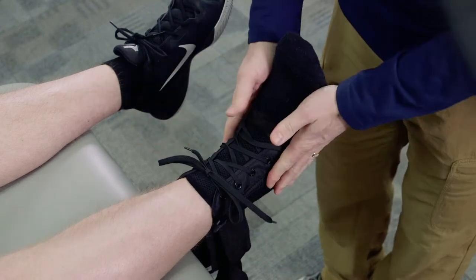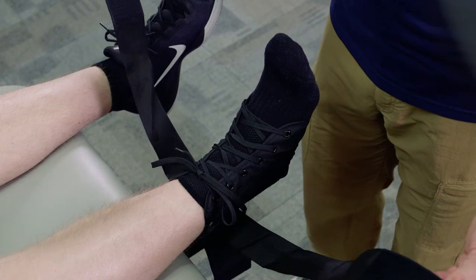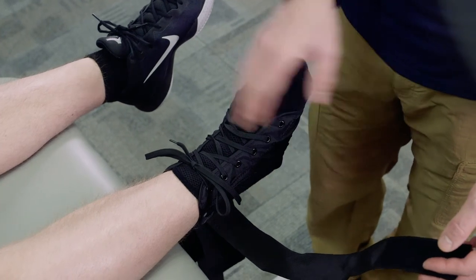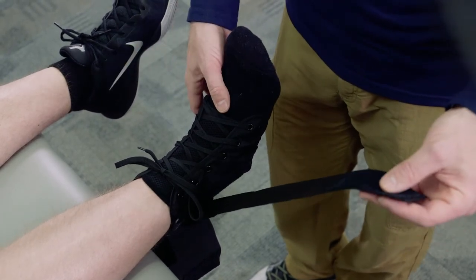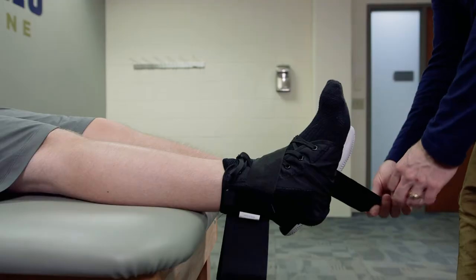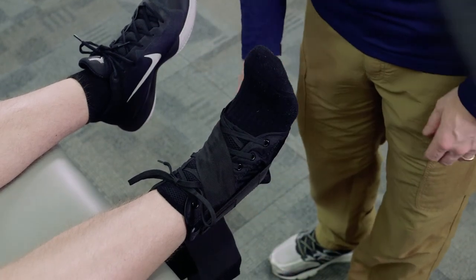Now that we've got it tight, we're going to use these side straps to provide additional lateral or medial stabilization. The strap we start with is determined by what type of ankle sprain we're trying to prevent. For preventing a lateral ankle sprain — the foot going into an inversion position — we start with this strap, and 80% of all ankle sprains fall into that category. We take our strap around the top of the foot to the medial side, then wrap underneath the foot and pull it nice and secure to the lateral side, pulling his foot into an everted position.